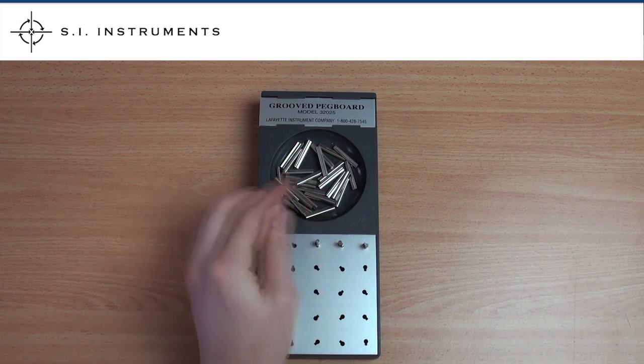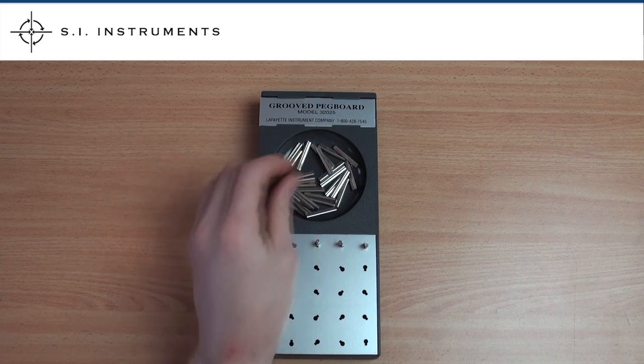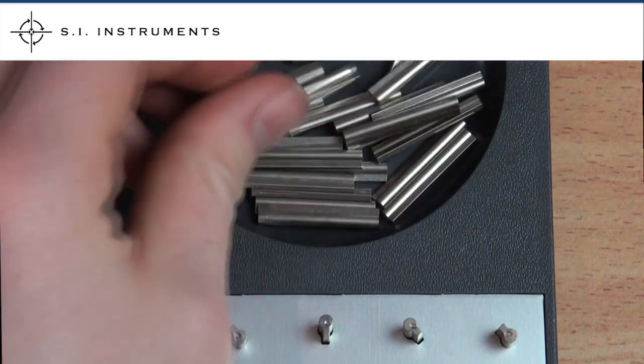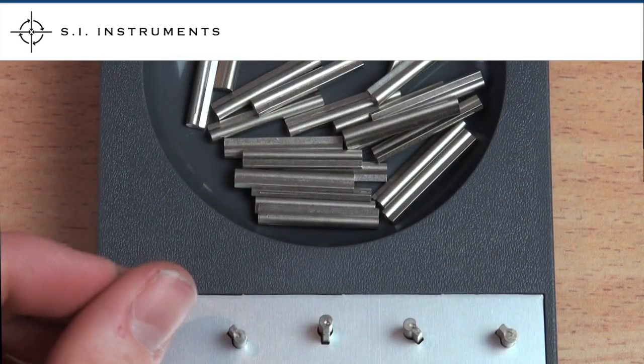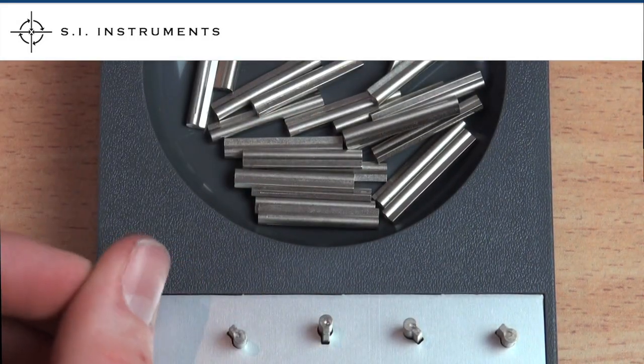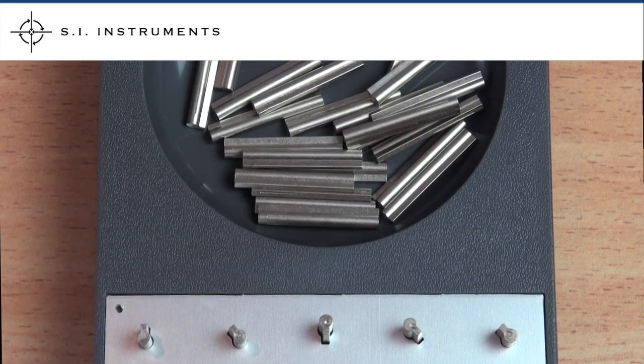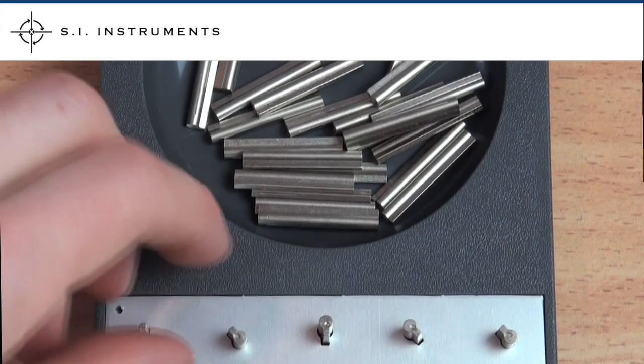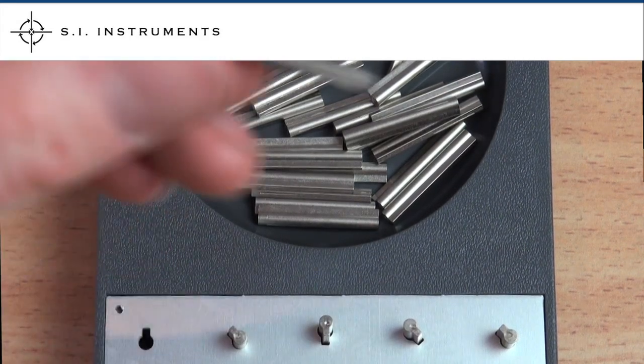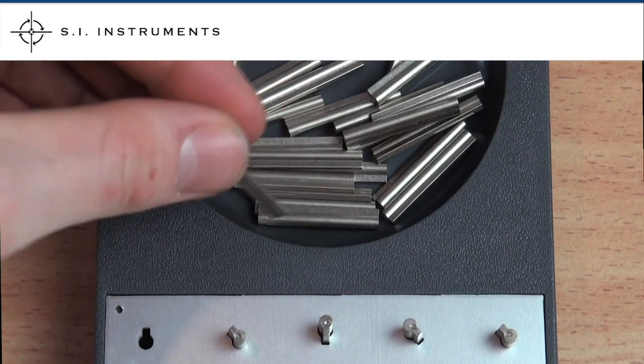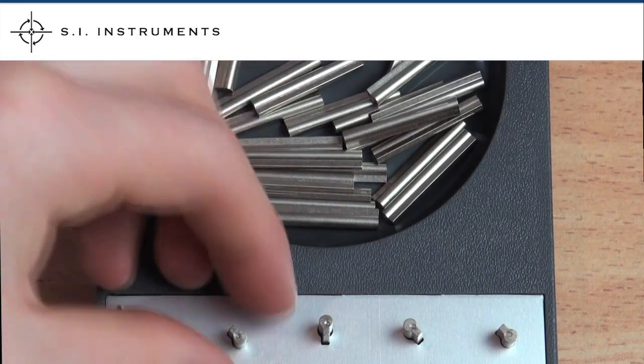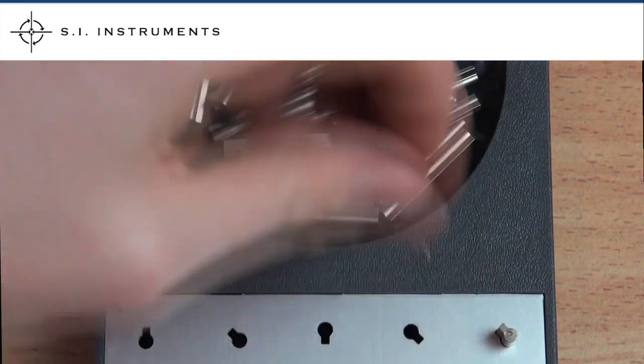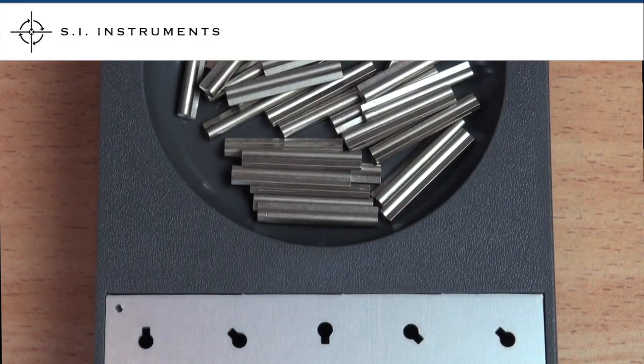To perform this test, the subject must match the groove of the peg with the groove of the board working left to right when using their right hand and working right to left when using their left hand. The subject must only use one hand to place the pegs in the hole. The test ends once all holes are filled.